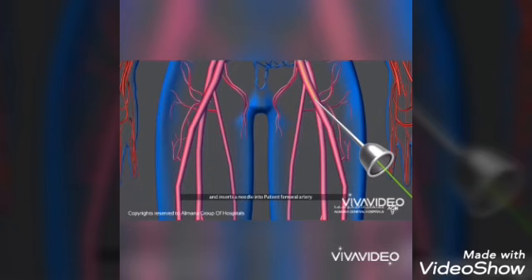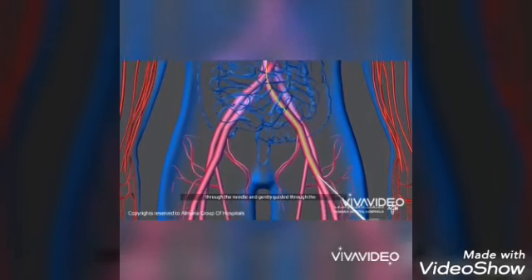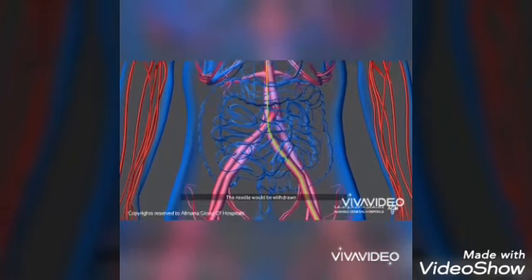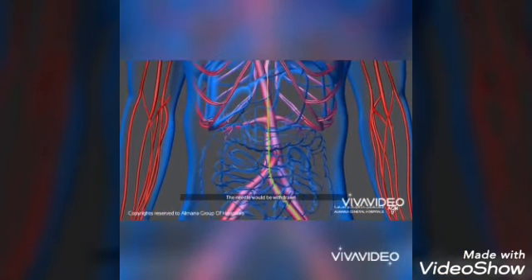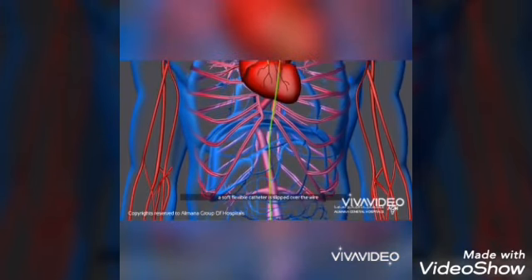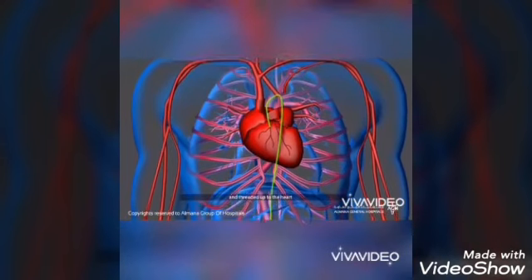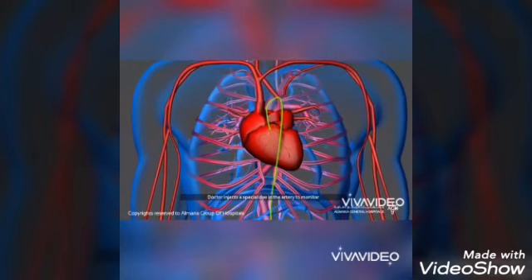This process begins with the insertion of a special needle into the femoral artery. Then a special wire is passed through the needle to guide it, and it is gently directed from the artery to the heart. Then the needle is withdrawn and replaced with a small flexible tube. The flexible catheter tube passes over the wire to reach the heart. Then a special dye is injected into the artery to monitor obstruction using an X-ray imaging device named fluoroscope.